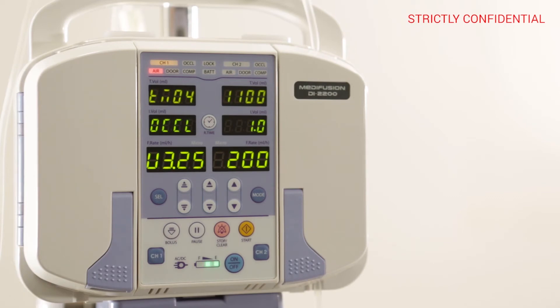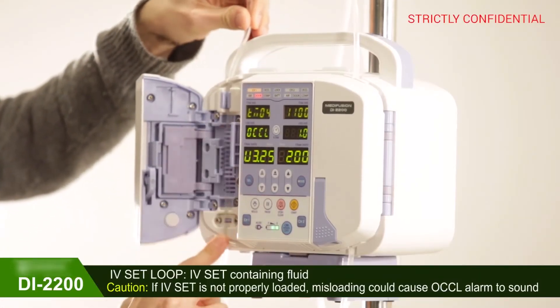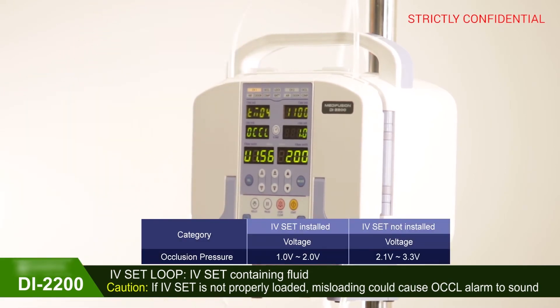The voltage value is 3.0 or higher when IV-SET is not loaded. The voltage value changes when IV-SET is loaded. Open the door to install IV-SET and then close the door. Check if the voltage value after loading the IV-SET loop varies between 1.0 and 2.0, which is the NORMAL voltage value range.